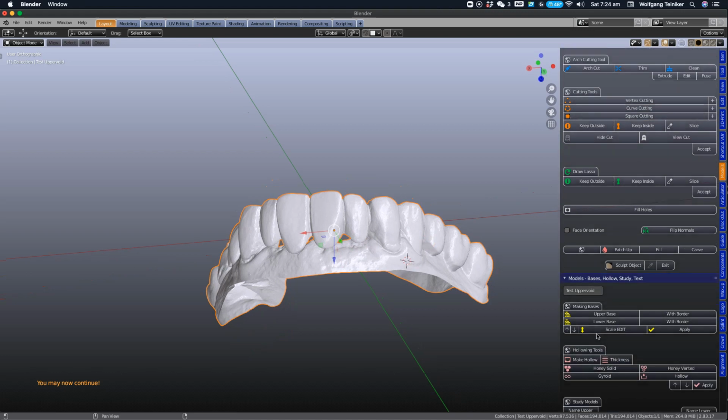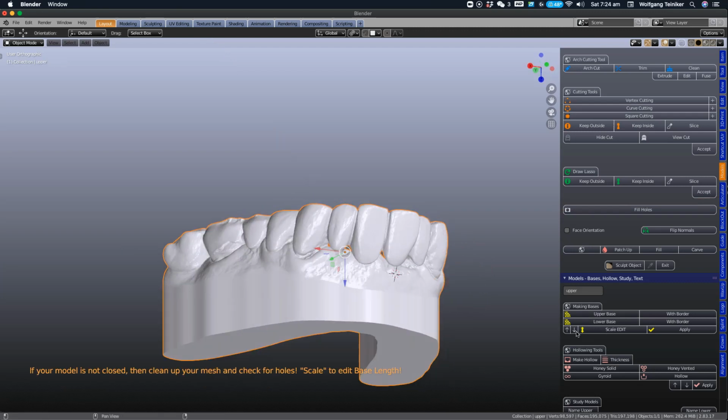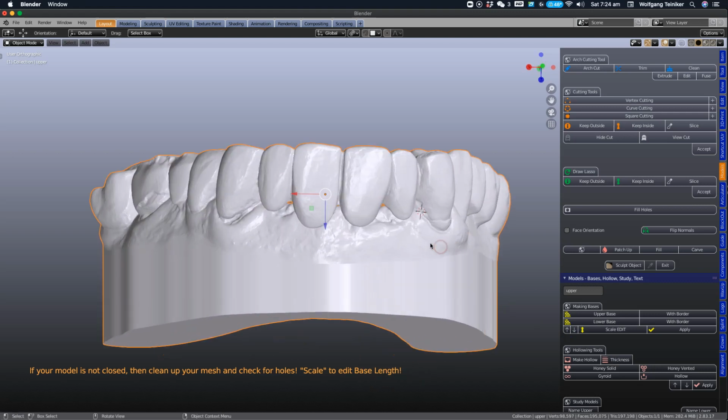I'm going to make the model next. So we're just going to press upper base. So this is normally a one-click operation, making models if you've got a clean scan. Very simple to use. Here we go. If you want to adjust the base, you can do that, shorter or longer. And we can even hollow it in a minute. I'll show you how to do that.